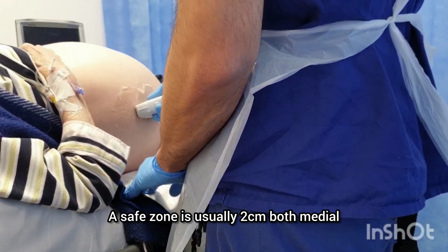Now it is time to discharge the catheter into the abdomen. To do this, you will bring both your hands to the blue connector point in the middle of the drain system. With your dominant hand, twist the proximal half of the blue connector anti-clockwise to unlock. This disengages the blue catheter from the metal guide needle.